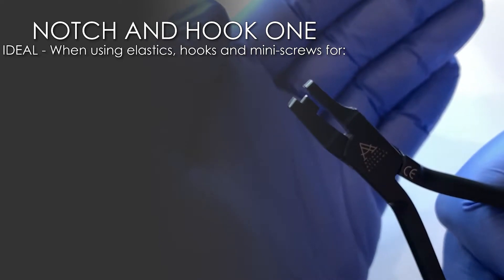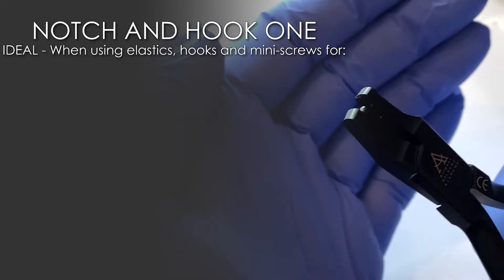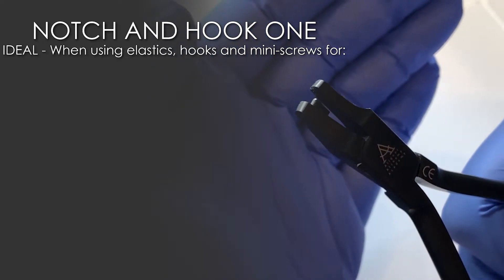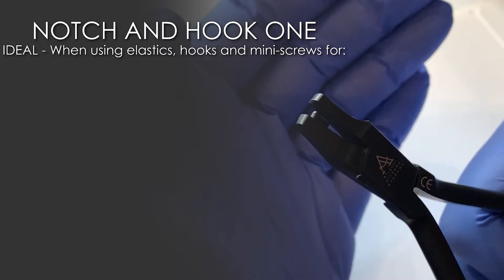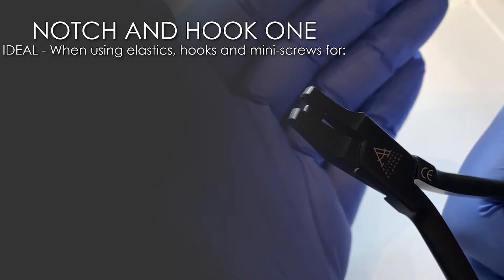The first plier we call the notch and hook one. We've given them simple words so that you and your nurse can understand the different shapes and configurations. This plier will create a key or tear shape. These are ideal for elastics, hooks, or mini screws.